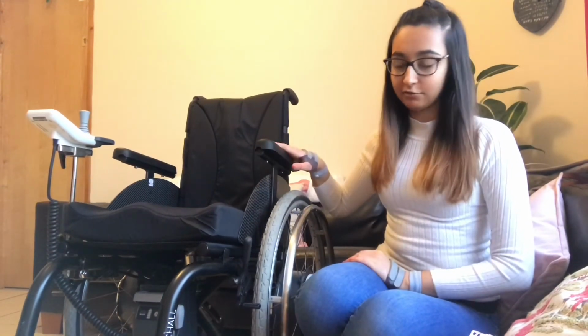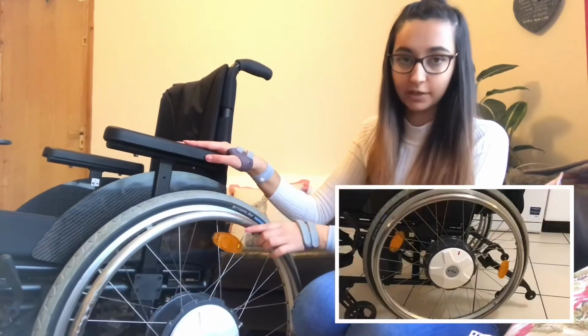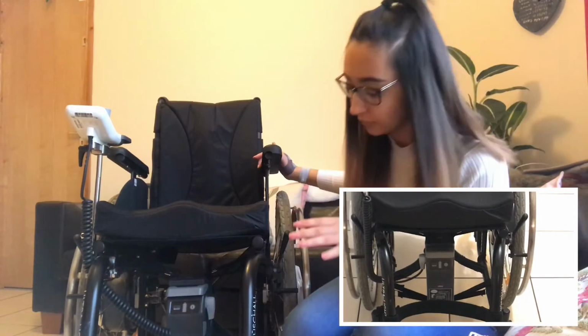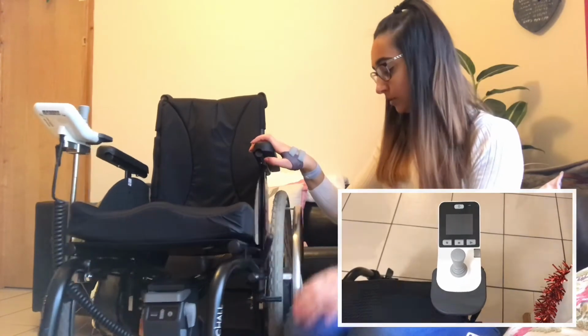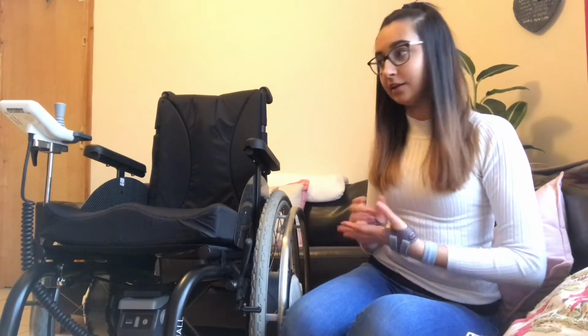And then in terms of the power assist on this one, it has powered wheels, which you can kind of see here, kind of not. So I'll insert a better picture of that, but there's a motor in the wheels, and then there is a battery pack right here. You can sort of see that, so I'll have to insert photos of all of this. So motor in the wheels, a battery pack right there, and then it has this joystick. So you switch the wheels on, and then it is controlled with a joystick, just like a powered chair would be, but then you have got the option to switch the wheels off and put them in manual mode, and you can either wheel yourself or someone that's pushing you can push you. And I really liked that it has the option for both.